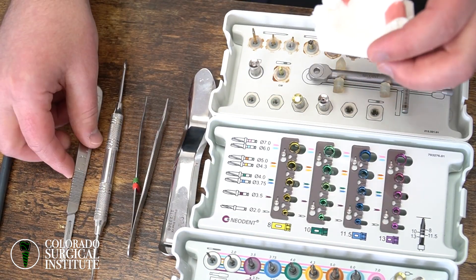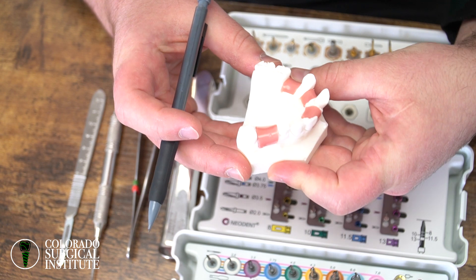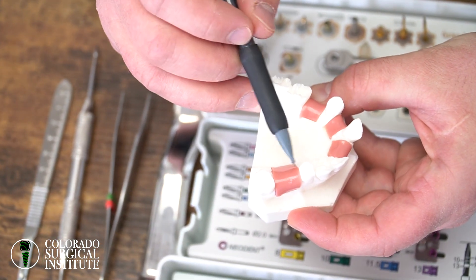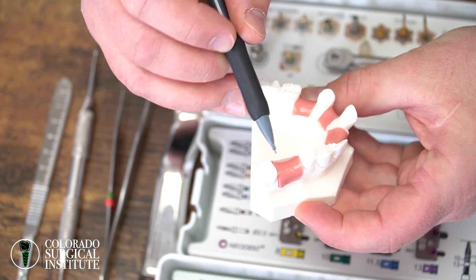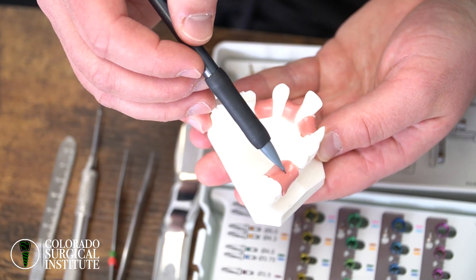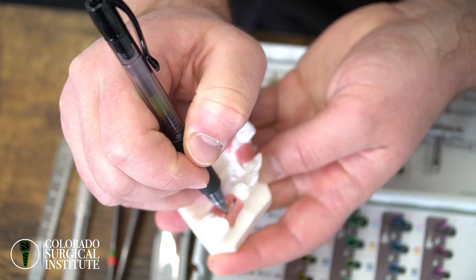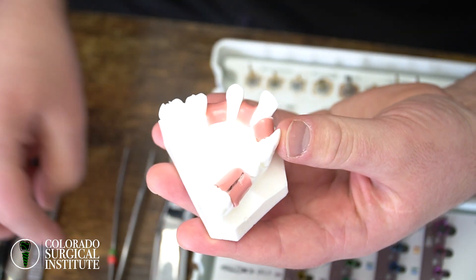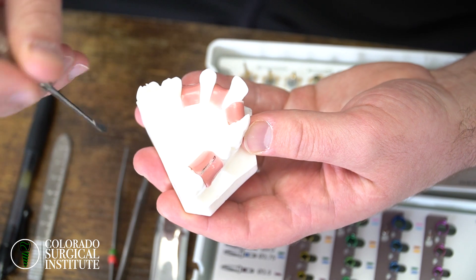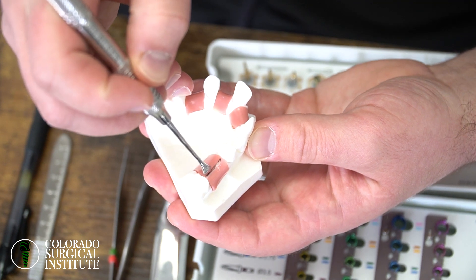So let's talk about incision design specifically. Looking here at tooth number 13 — you can almost call it 14 with how wide it is. There are a couple of spots you could put it. Let's say you do a mid-crestal incision right down the middle of it. This is lingual here and that's buccal, so right in the middle of the two.